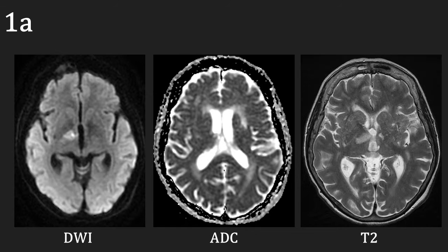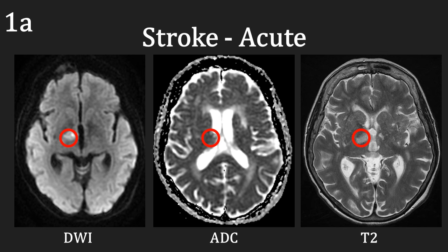Now on to some cases so we can put this knowledge into action. Our first case is of a 77-year-old female patient who presented with an unresponsive episode, preceding drowsiness, left-sided facial droop, and slurred speech. She is known to have had a previous stroke and is on medications for hypertension. On the DWI sequence, we can see an area of high signal in the right thalamus, with low signal on the ADC and which is matched with the high signal on the T2. This represents an acute infarct or stroke.